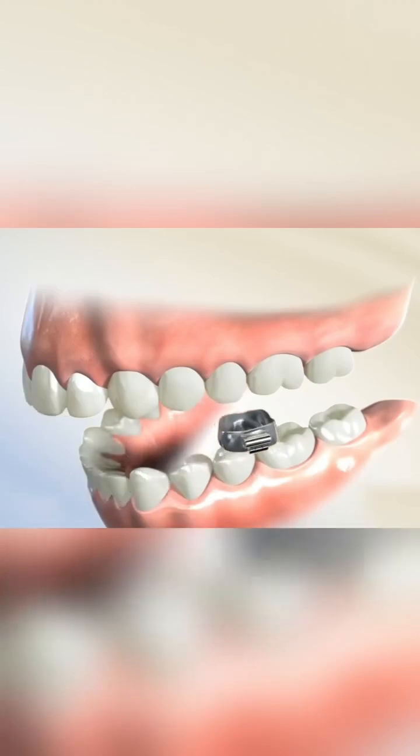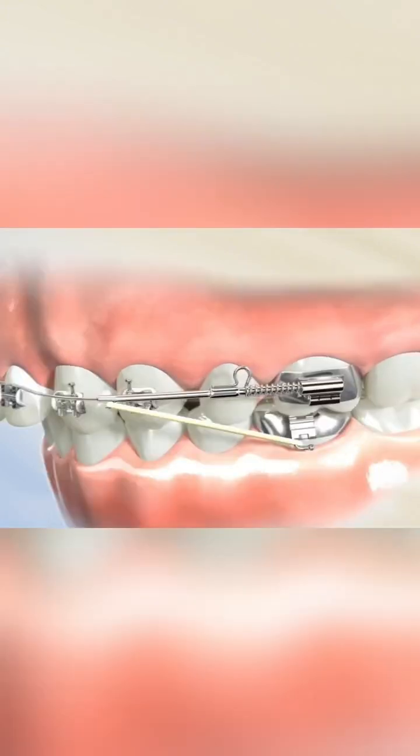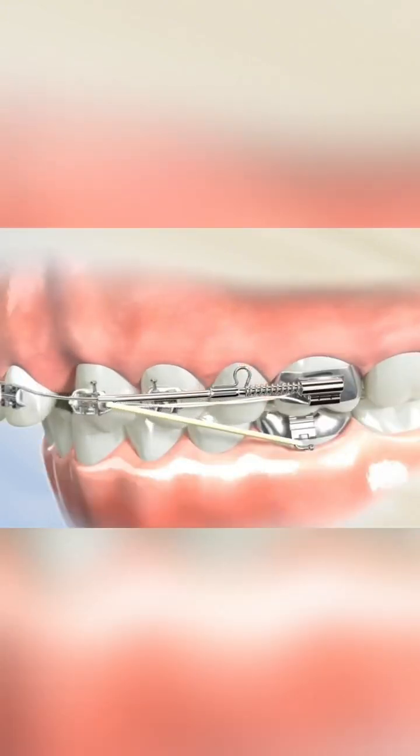Metal brackets are attached to each tooth and connected with metal wires. The orthodontist will periodically adjust these wires, applying appropriate pressure to gradually move the teeth into their ideal positions.